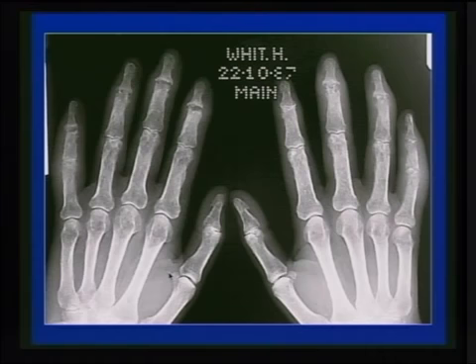Most of us, in the usual day-to-day work, will be faced with this type of examination. Sometimes we think it is difficult or not difficult, but what I mean by presenting this one is that we should have a systematic way of looking at joint x-rays.